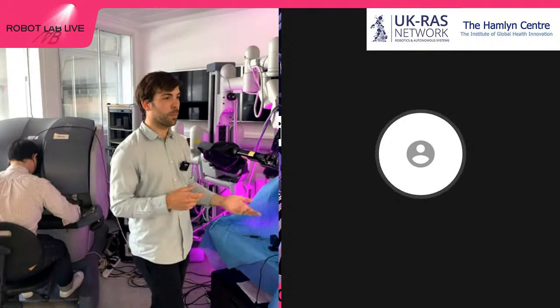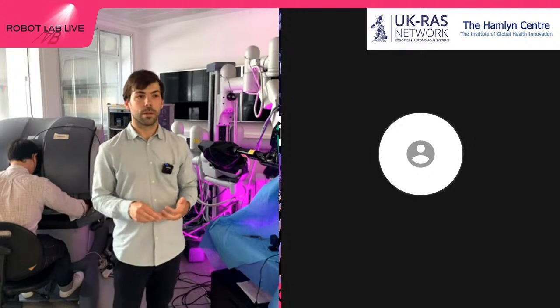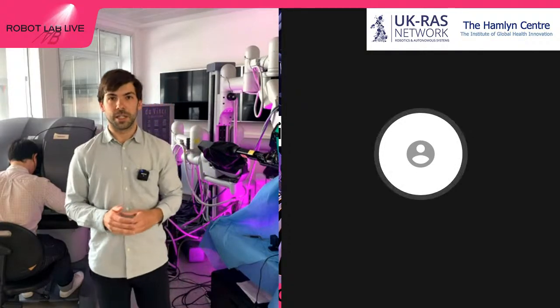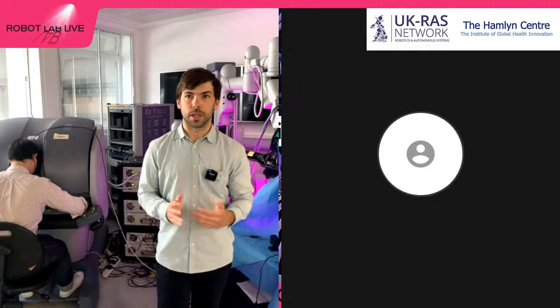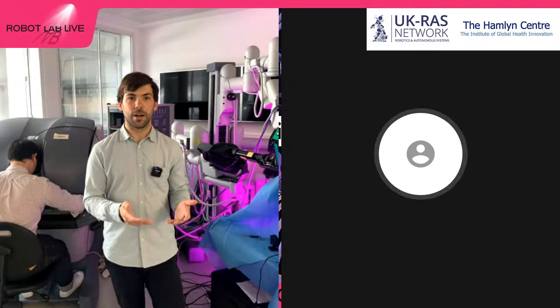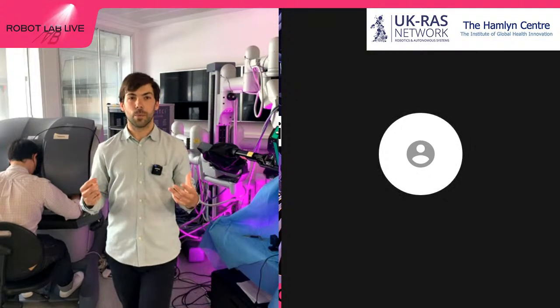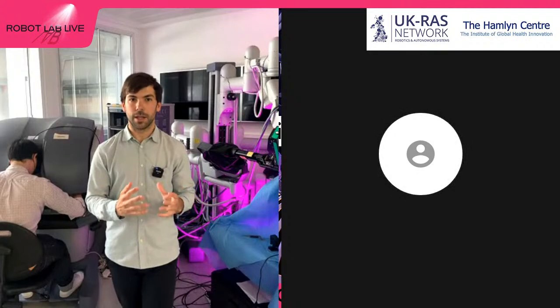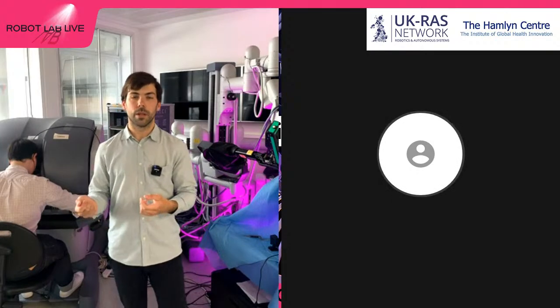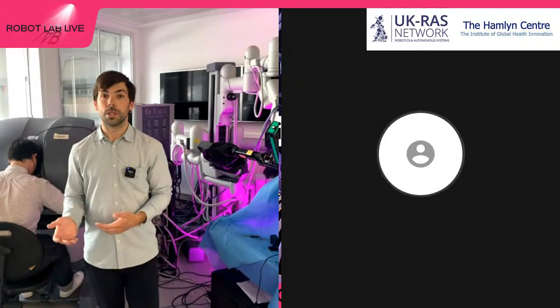Another problem that you might be noticing in this setup is the risk that using this robot might have, right? The surgeon knows what his target is, which is the lemon. But when we have an autonomous robot, how do we tell the robot which one is its target, right? So in that line, we can implement no-go areas and create a safety box in which the robot operates. And in that line, we also have some researchers. In this case, it's Seiyan, who is working on such cool stuff.